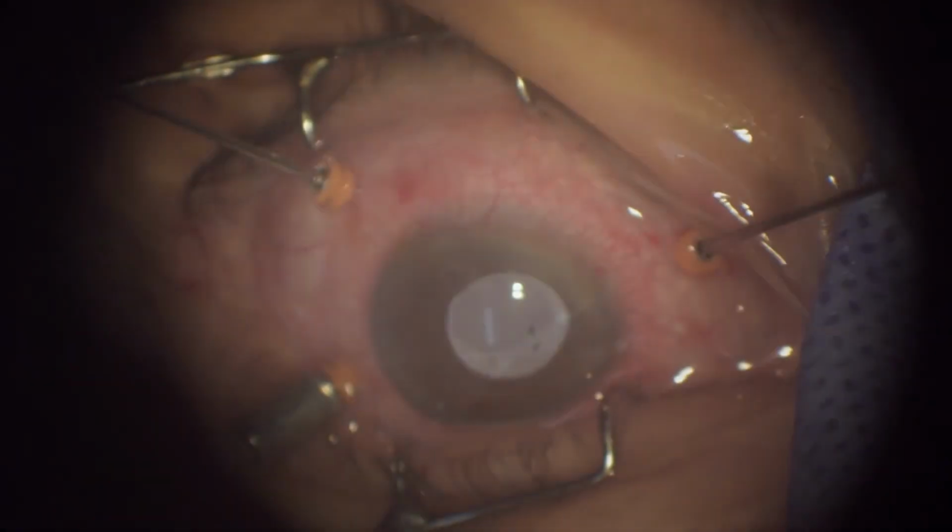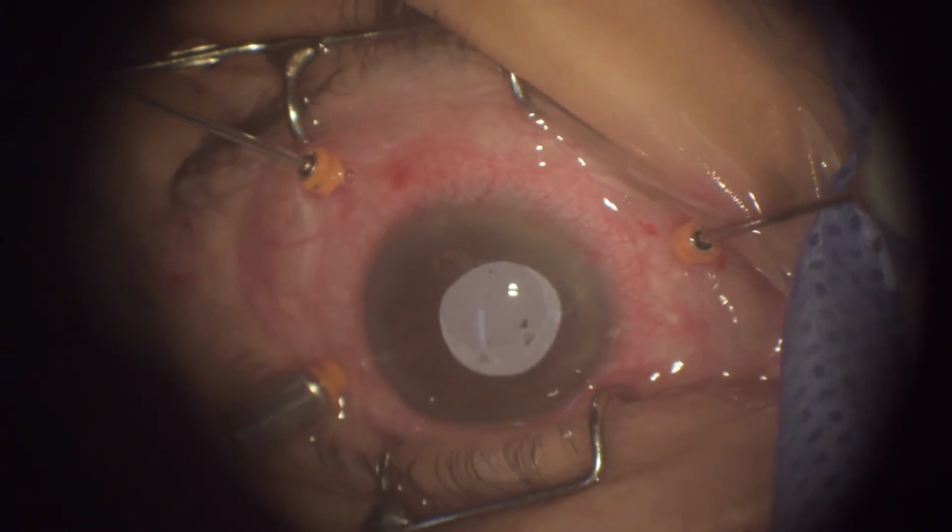We keep moving the retina in other directions, trying to get rid of the RPE cells, as you see. This is an inverted vitrectomy. You see the instruments up, and then now you see them down. You put the retina back to the original position, and now we are able to insert the PFO.